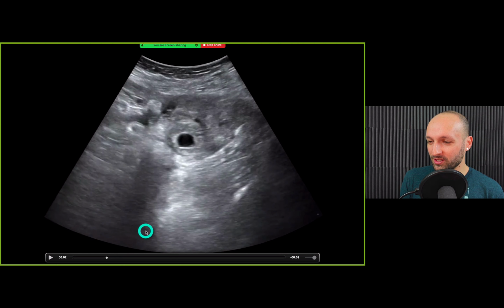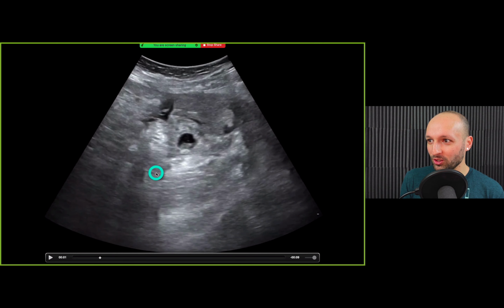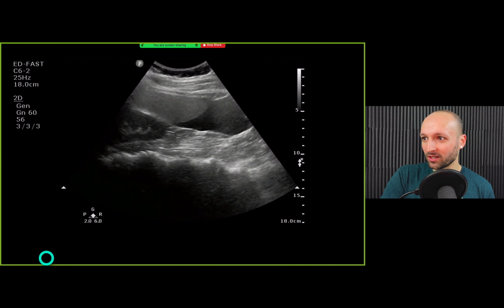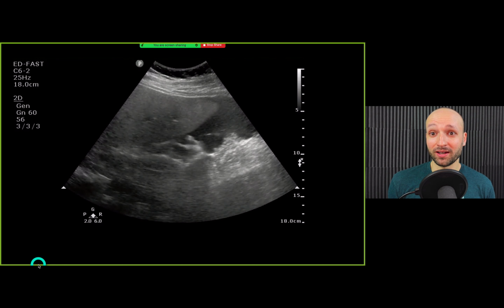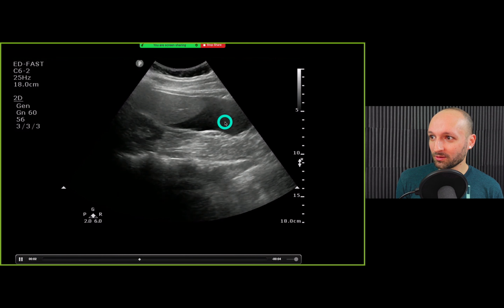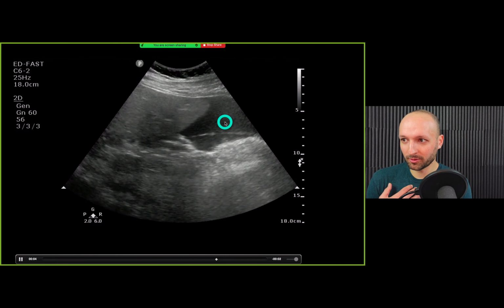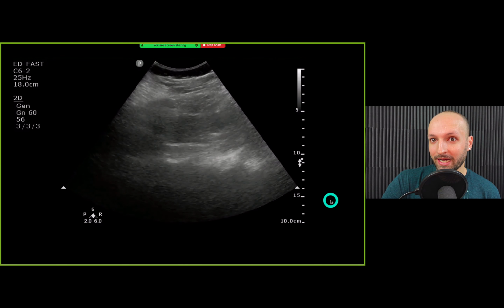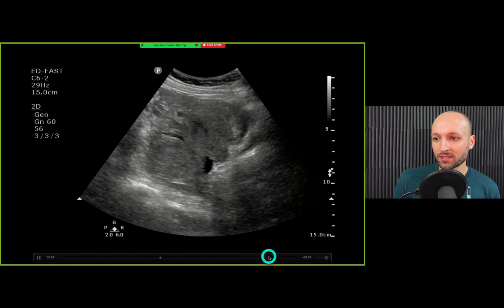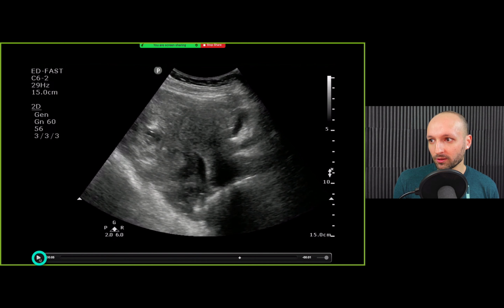This right here is this gestational sac outside of the uterus, kind of within all of this stuff, which is all clot. Here is another patient that presented with acute abdominal pain. You guys see this right here? What is this? What do we got here? It's a positive FAST in the right upper quadrant. And this is that patient's pelvic view.